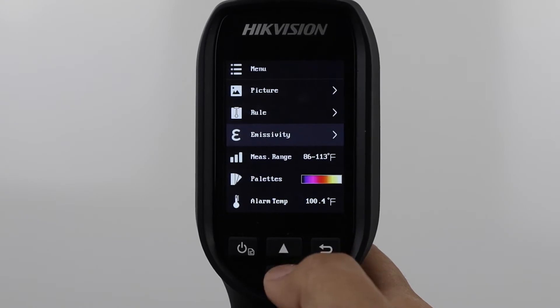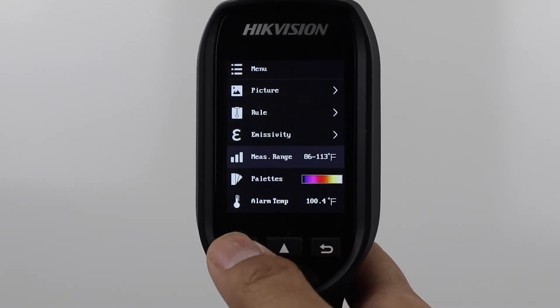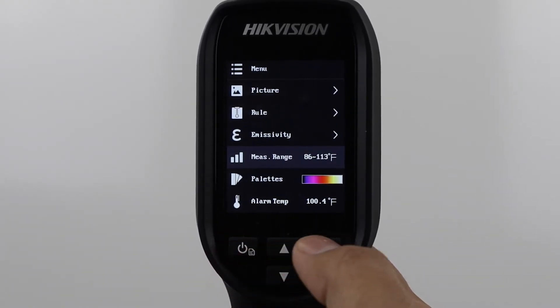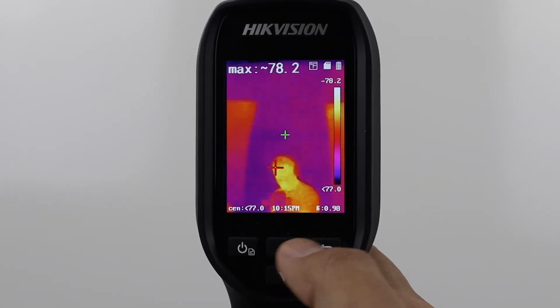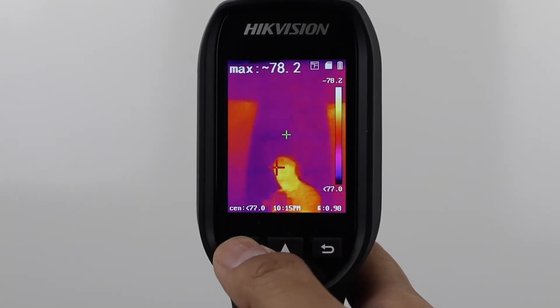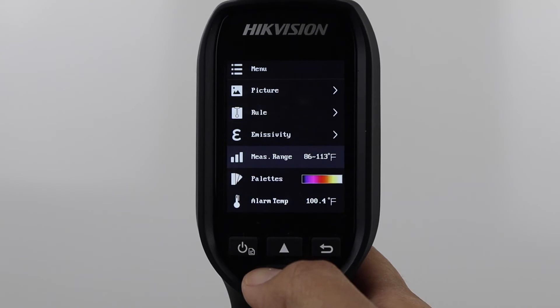Measurement Range comes set at 86 to 113 degrees Fahrenheit as standard. We recommend that you leave this set as is for body temperature.